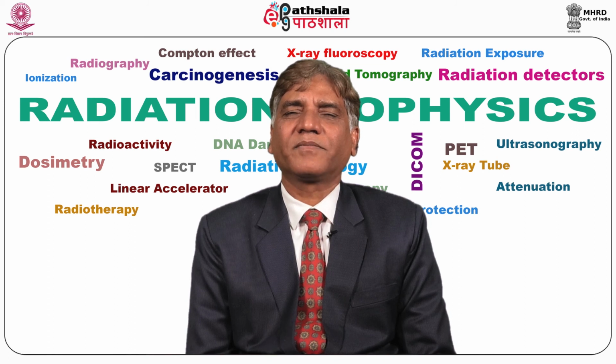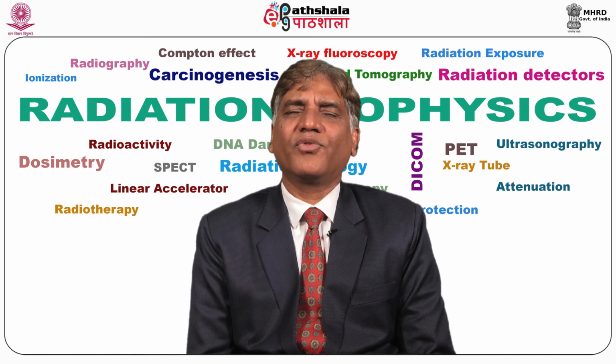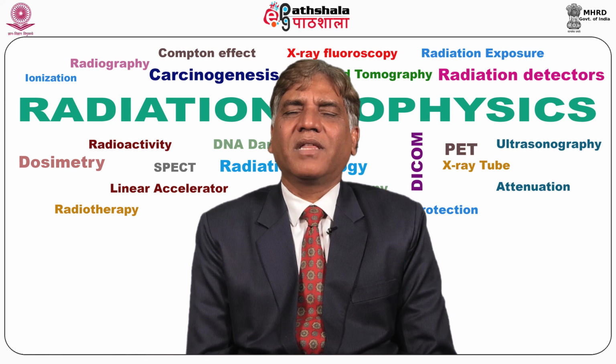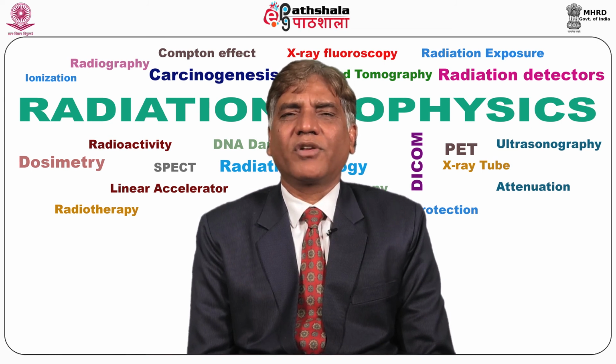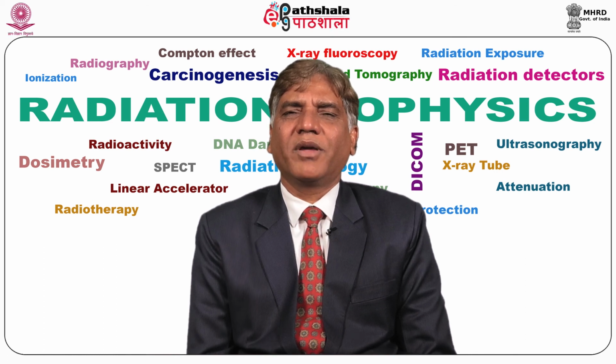So the structure of the transducer is that the main heart of the transducer is a piezoelectric element, usually lead zirconate titanate, PZT. That is the heart of the piezoelectric ultrasound transducer. And in the structure of the transducer, we have the piezoelectric element, we have the backing layer, we have the matching layer.